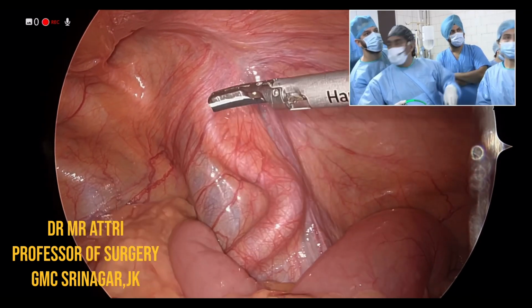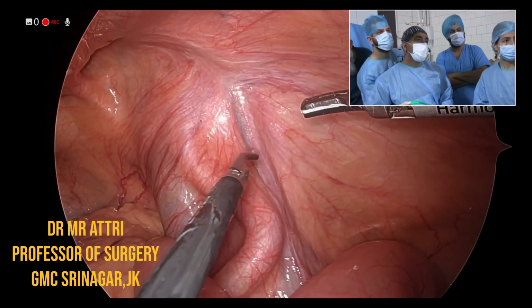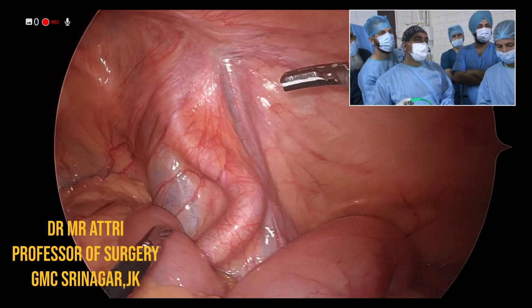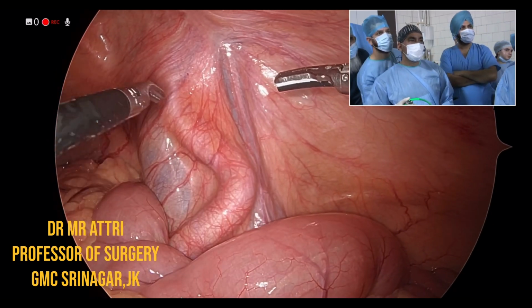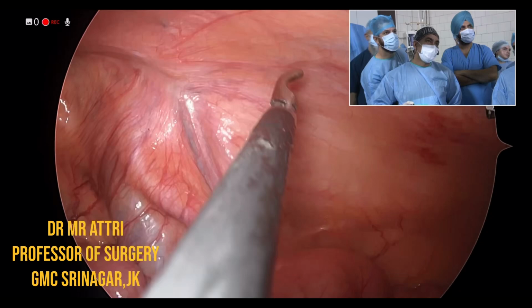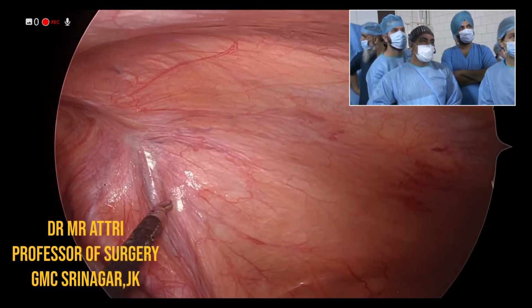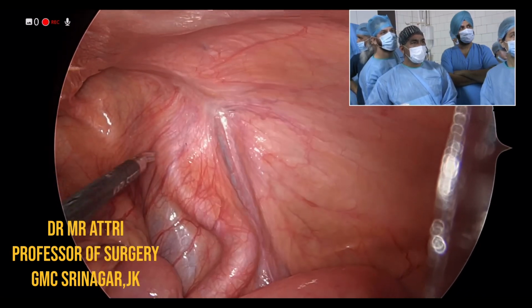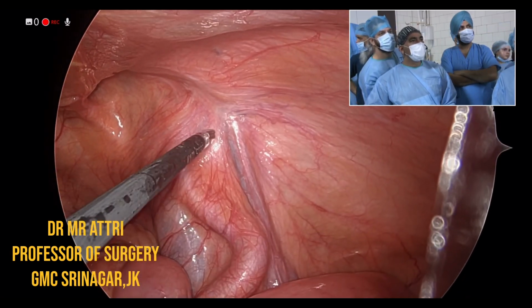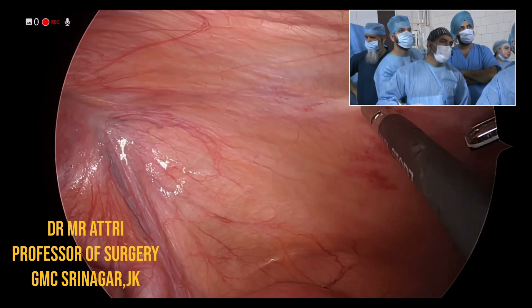Can I request the anesthetist to please put the patient in head low position. And this is the vein as we know, and this artery is going like this. Maybe just a bit of anomaly here, but these are the testicular vessels as we know, and this is the internal ring. So this is the angle of doom here, and now we'll proceed with the incision.